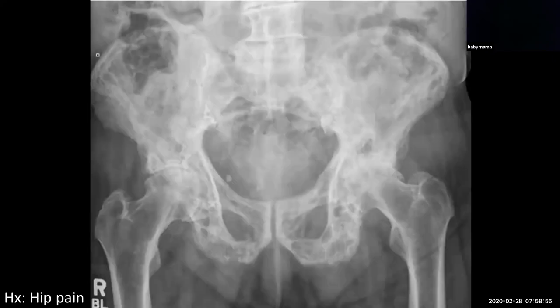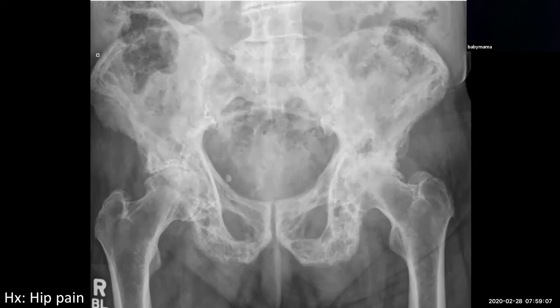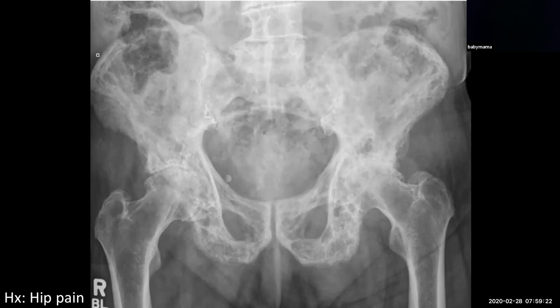How about this case? Patient with hip pain. The alignment is good, cortices are good, but the bone mineralization is irregular — thickened, coarsened trabecula with expansile appearance of the pelvic bones, particularly the iliac bones and sacrum. This is another case of polyostotic Paget's disease. You can confirm by looking at other bones or laboratory parameters — alkaline phosphatase and other bone markers that indicate increased bone turnover.